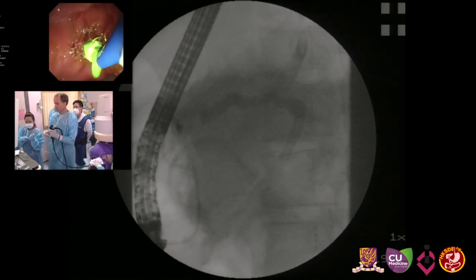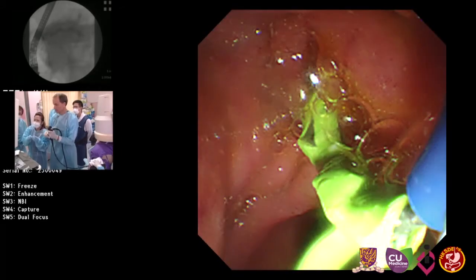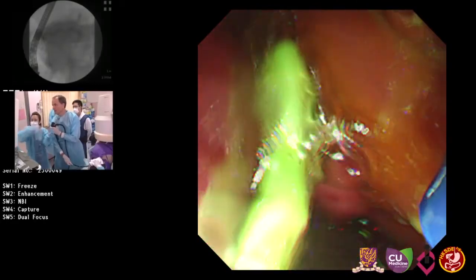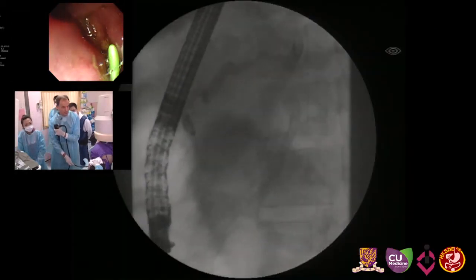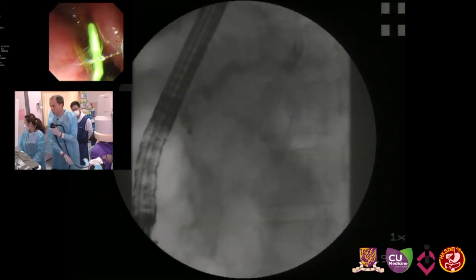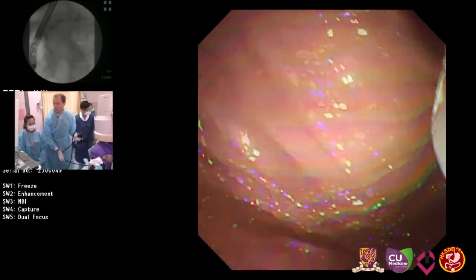Now we release the stent. So we take it off. Okay. I take the wire out. And everything out, right? Yes. Still a lot of stone fragments coming out. No, I think it's in a good position. As you can see on fluoroscopy, it negotiates the stricture and is free in the lumen. Good. Thank you. Nice demonstration. Thank you.